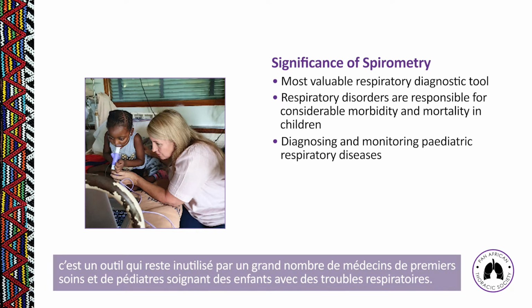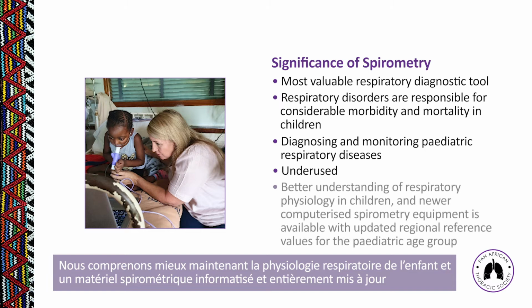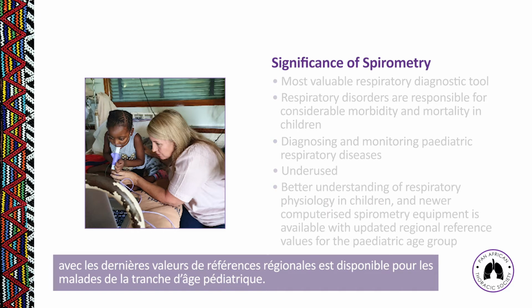But it is currently underused by primary care physicians and pediatricians treating children with respiratory disease. We now have a better understanding of respiratory physiology in children, and newer computerized spirometry equipment is available with updated reference values for the pediatric age group.